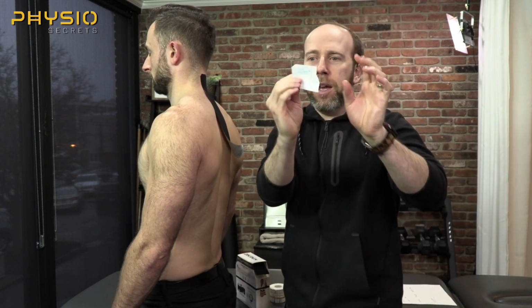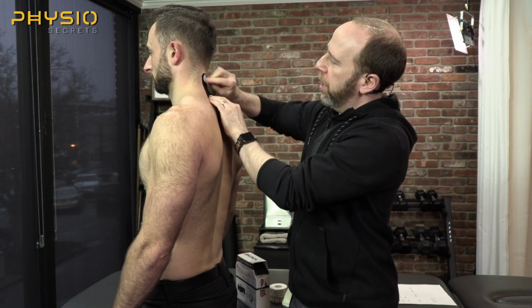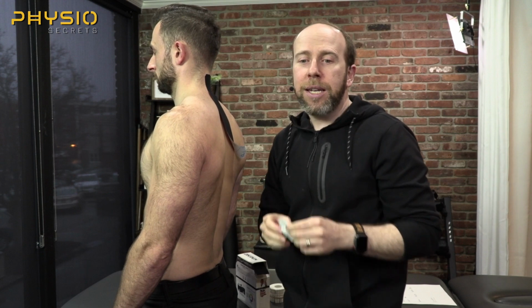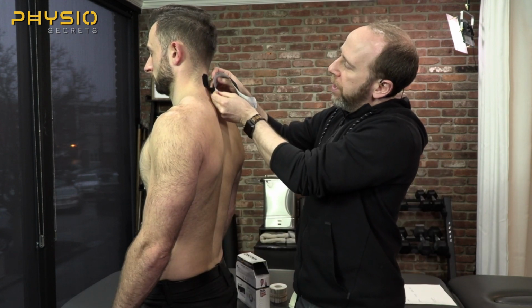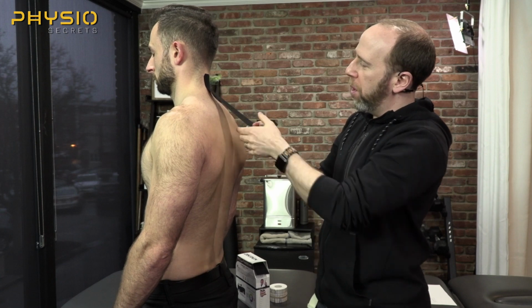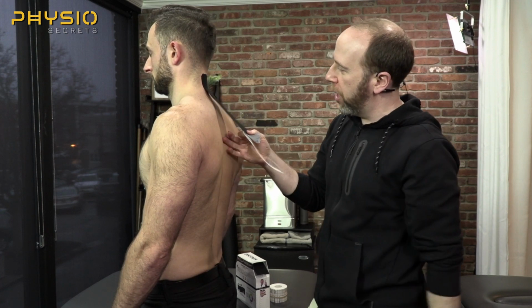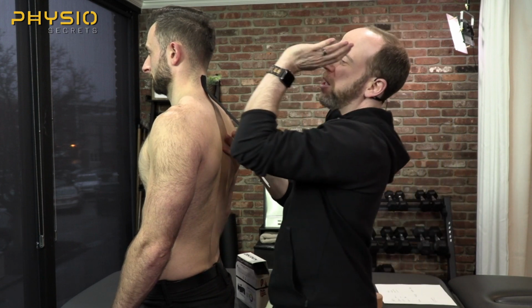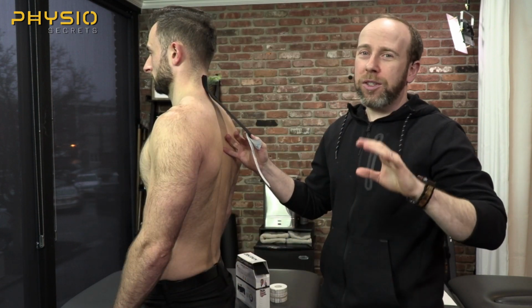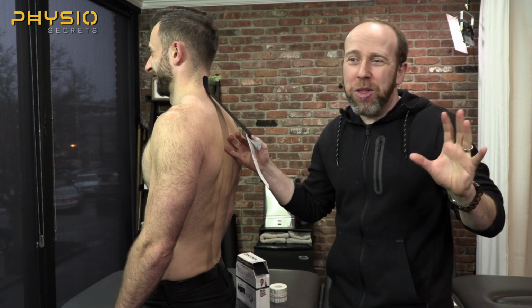You can use the backside of your tape. Some people will use this to kind of rub it. If you heat that tape up a little bit, it sticks a lot better. Okay, now, let's just say for 1 second I taped him in a neutral position, a neutral pre-position, with no tape stretch, and I just laid this tape on. He wouldn't feel anything until he bent his head all the way forward. That's stupid, because I want him to not do that.